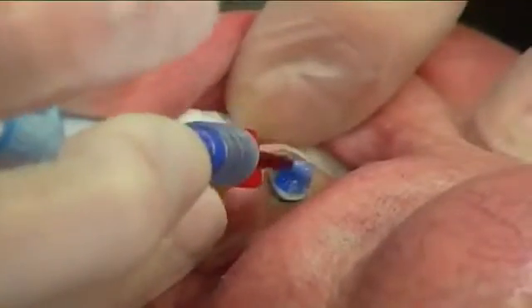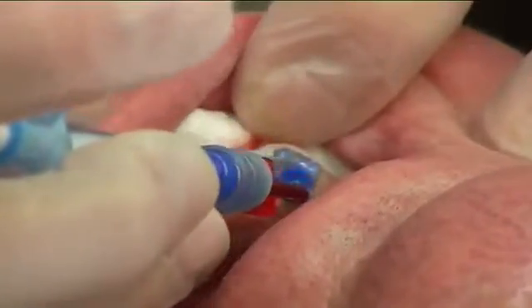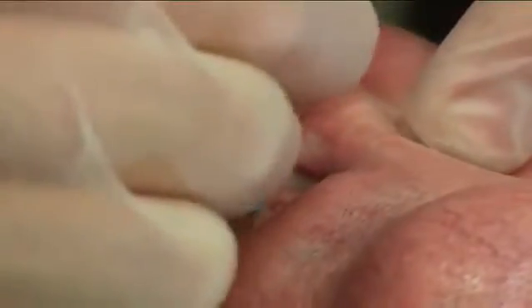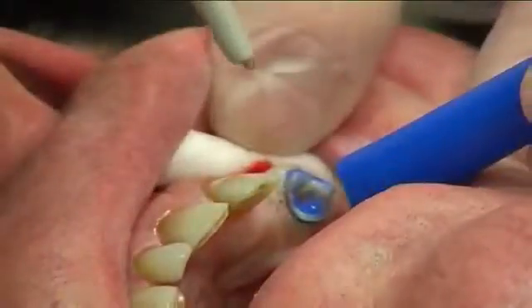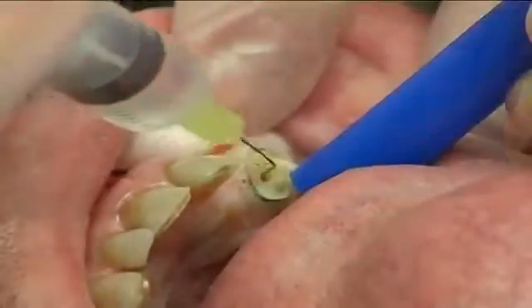The root canal was etched according to the cement manufacturer's instructions. The root canal was then rinsed and dried using paper points.